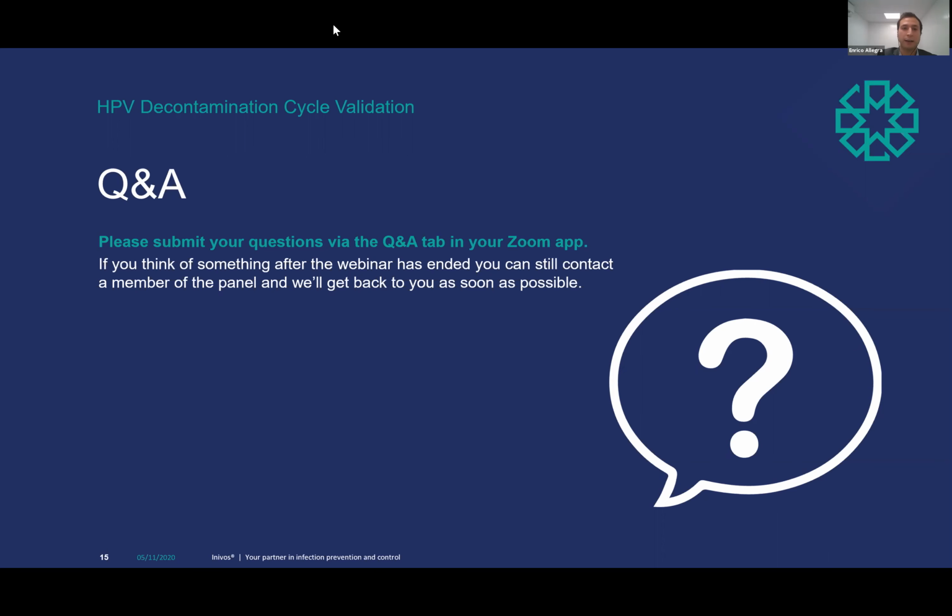Yeah, absolutely. I think the key word here is validation. Trials, validation, and that will eventually give you the ultimate confidence that once you run your cycle, you actually achieve the killing. I just wanted to point out that the thumbs up is not actually telling you that everything is dead. Thumbs up is only telling you we achieved every single parameter that we set.